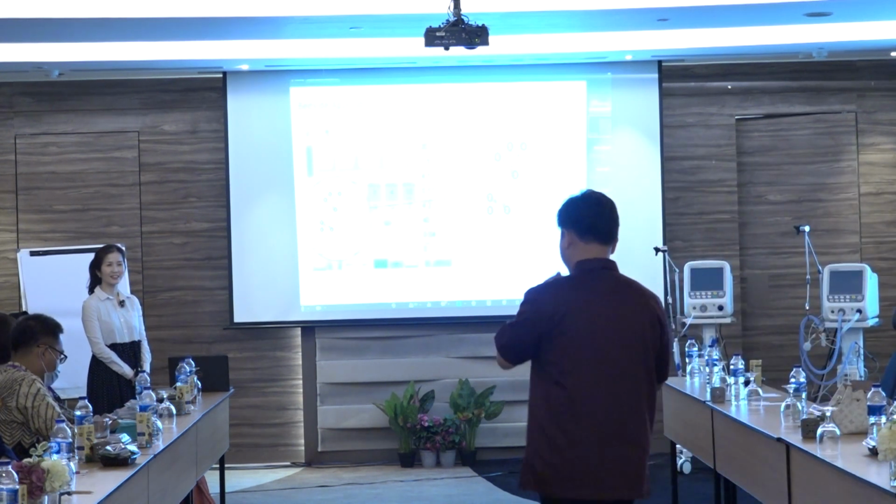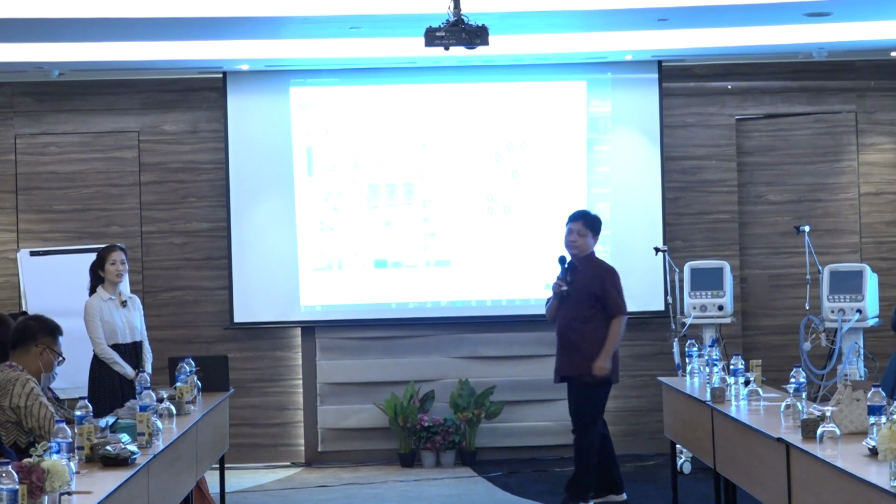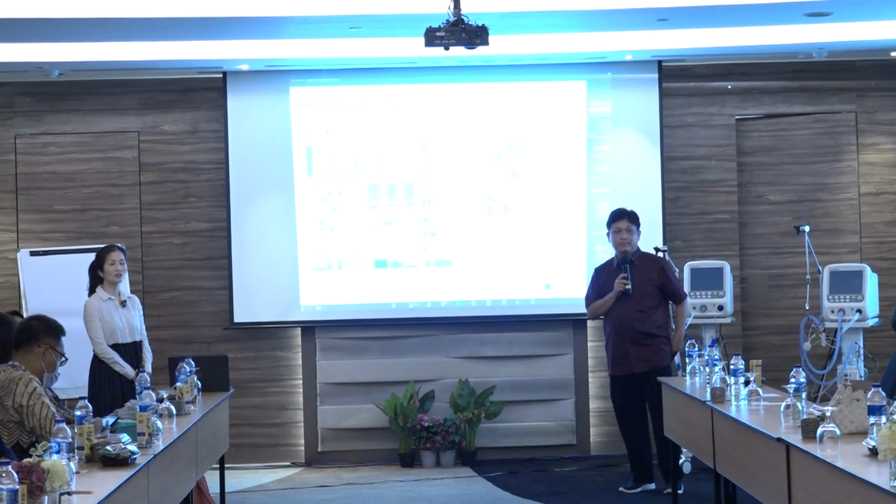My question is, in which situations do we recommend starting to use the FOT? Because as we know, if we increase the PEEP, the hemodynamics will also change, especially the stroke volume will reduce, and hypotension can happen because the cardiac output will get lower. In which situation do we recommend using the FOT?